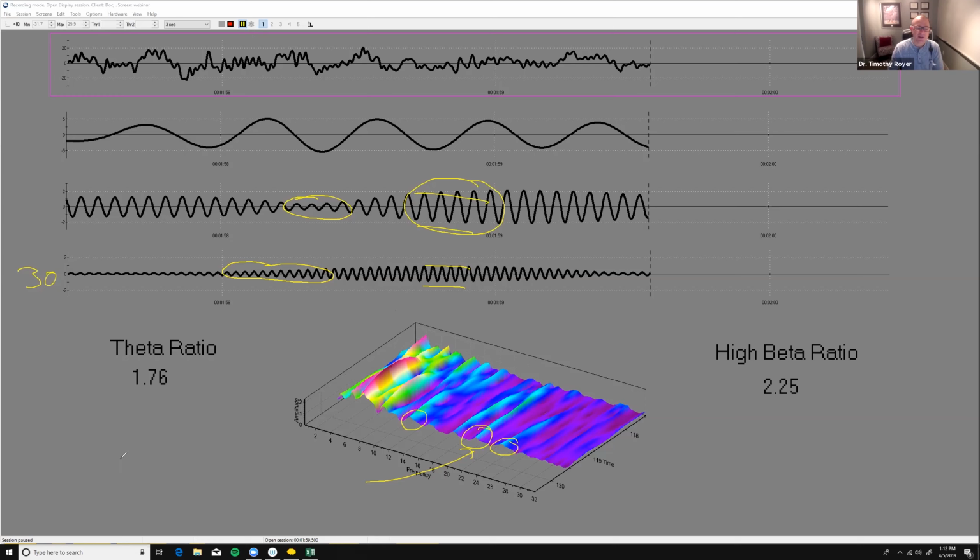So if I take Bill, he's always Bill. But as he gets older, he might get taller, or he might get stronger, or he might change in some way physically in how he's seen, but he's always Bill. A delta wave is always a delta wave, but it can change in how it looks.